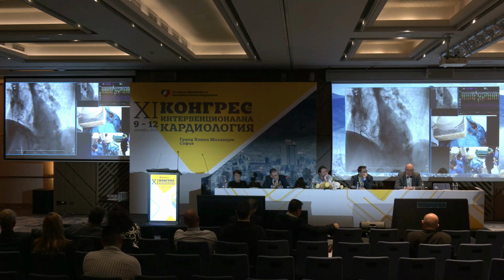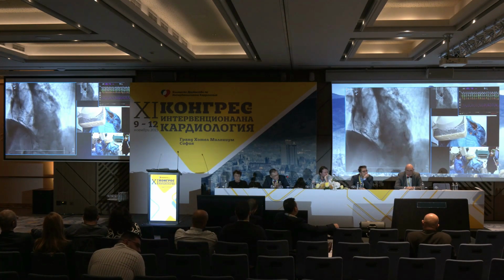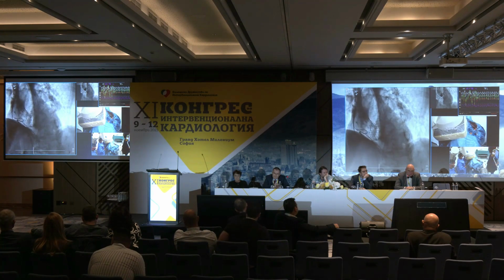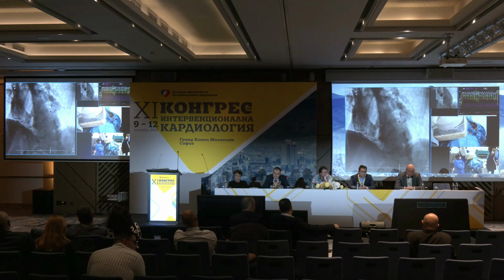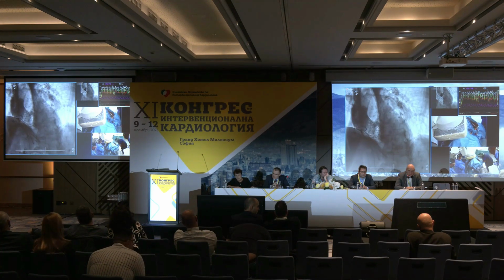So usually what we do, we implant a pacer irrespective of whether the patient regains the rhythm or not. But very good note. Even in case of left bundle branch block, it also elevates the probability for permanent AV block. But yeah, we'll see. There are different scenarios. We are going to wait overnight, and probably tomorrow we are going to implant the pacer.